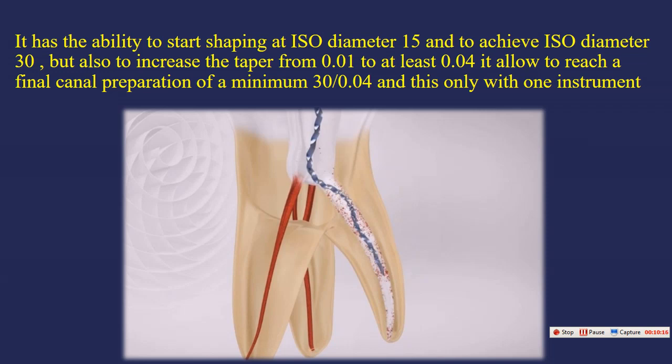Tapering with standard NiTi is 0.02. This increases the incidence of fracture or microcrack and stress on the dentine wall. The benefit of this instrument is gradual tapering, meaning making the preparation narrower apically and wider coronally. This reduces the incidence of microcracks or stress on the dentine.